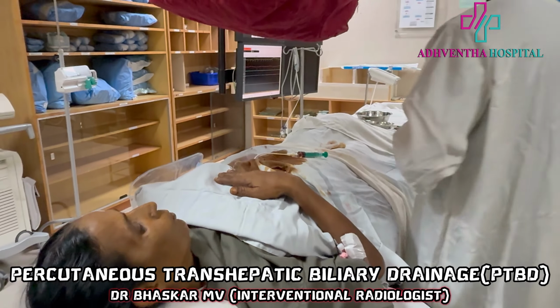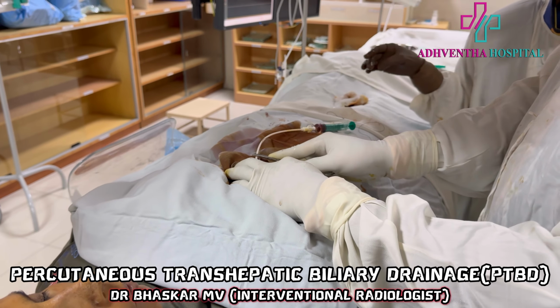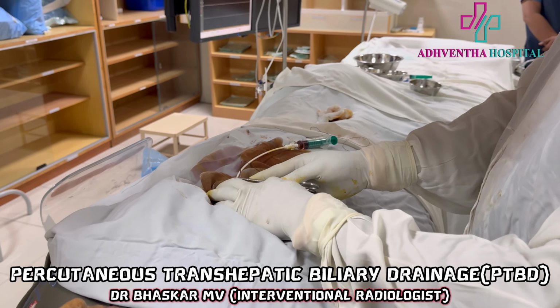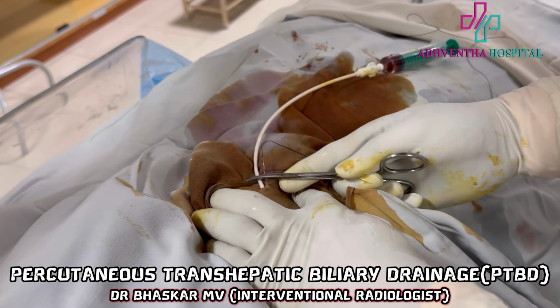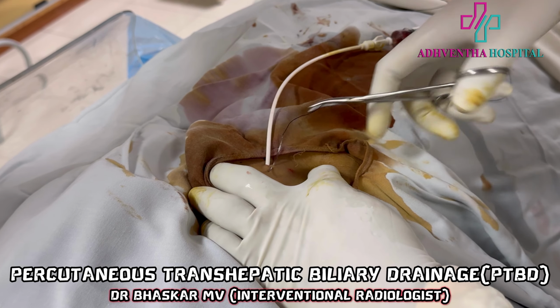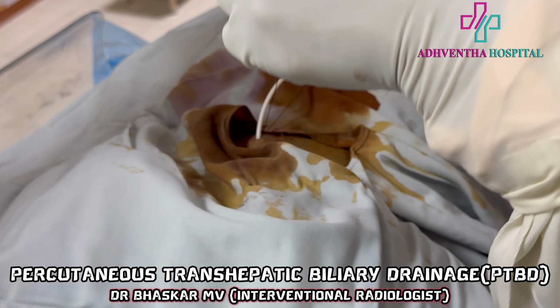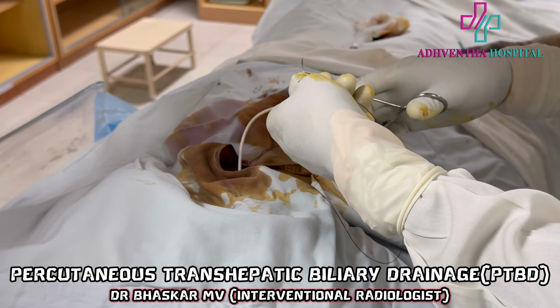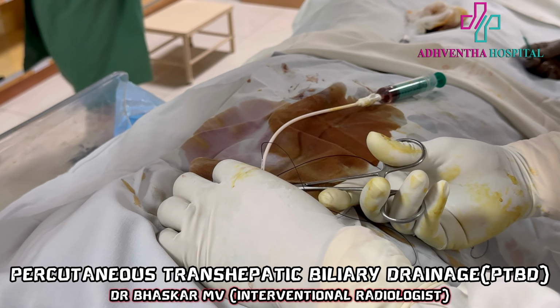Okay. Suture. Just a small suture will be done to secure this tube. And the tube is externally connected to the drainage catheter bag. Sometimes it can drain internally.